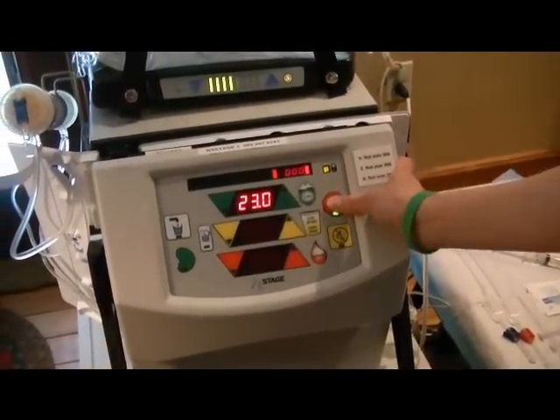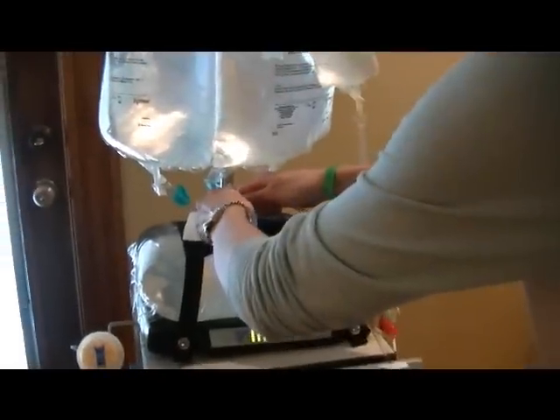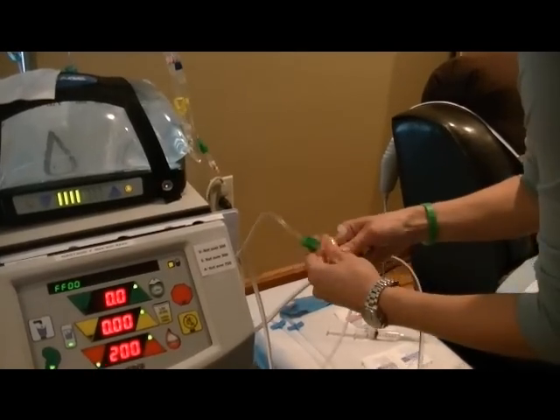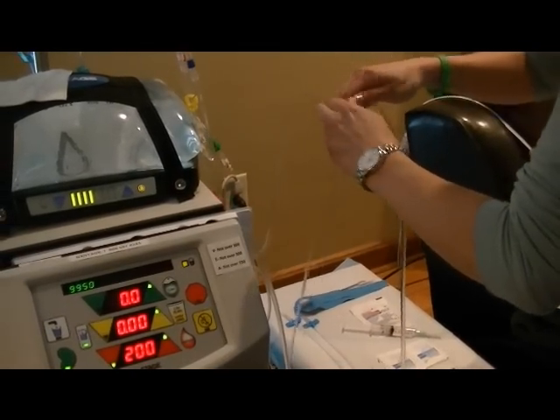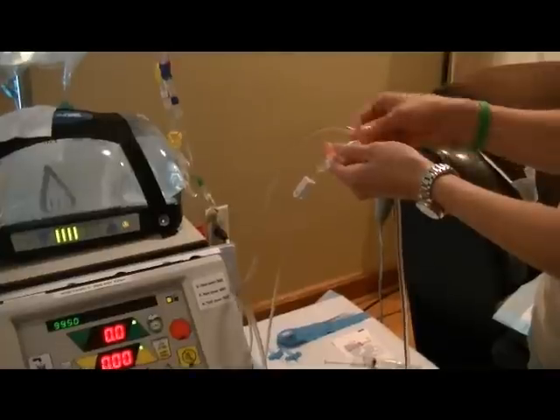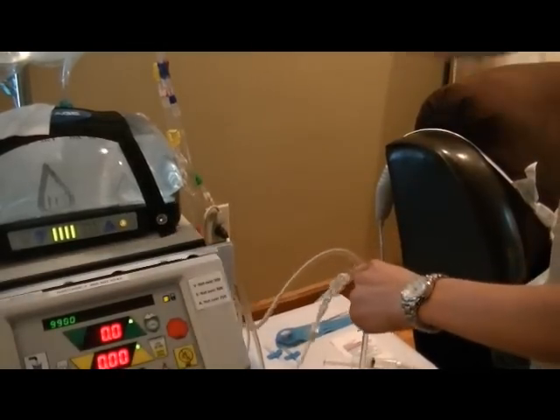Once you've done all the snap and tap, you press stop. Then you have to drain — this is the saline line here — and you drain it and clamp, then unhook these two. You leave those clamps closed. The only reason you would open them is if you needed to do a manual rinse back, if we needed to actually add fluid to him if he was dehydrated or under his dry weight, or if he starts cramping during the treatment so you can open these up and give him some saline.